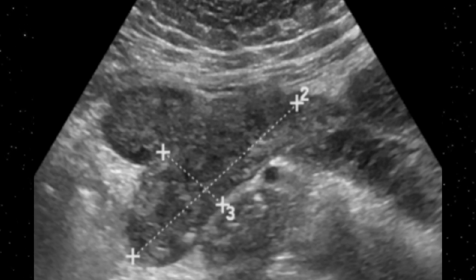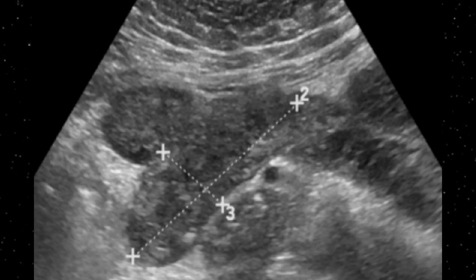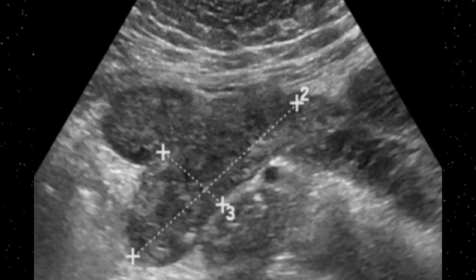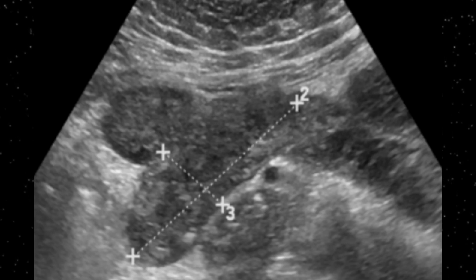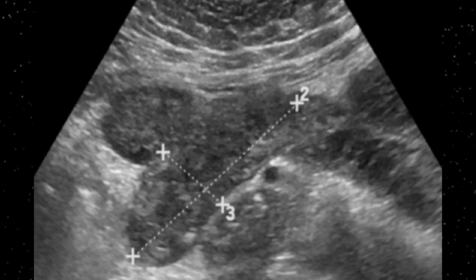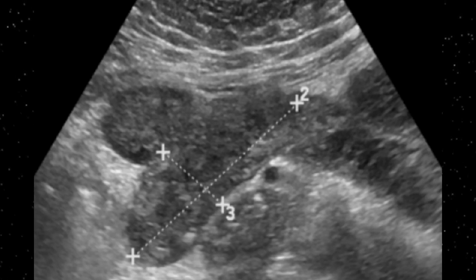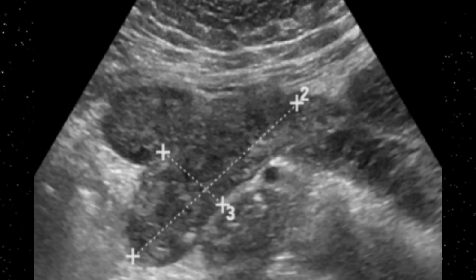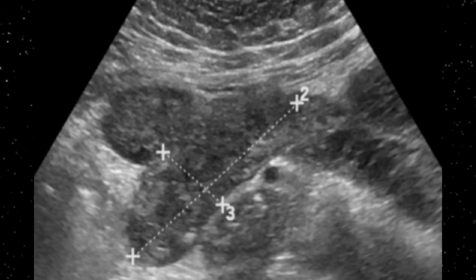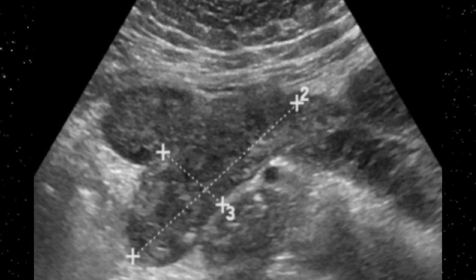And the important thing is to look especially at the right ovarian vein, because the right ovarian vein is involved in almost 90% of cases. So always focus on the right-sided ovarian vein, and if you do find these features, this would definitely be ovarian vein thrombosis.